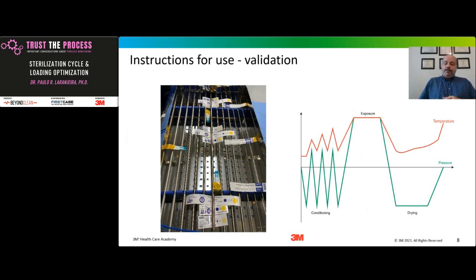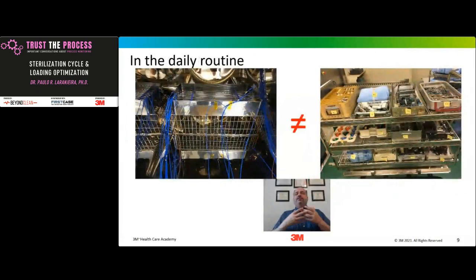Therefore, you need to follow the instruction for use, but you cannot say that that instruction for use is going to represent the same cycle and the same configuration that you have in a hospital. So this is the first point that you need to understand. When you read the instruction for use, that instruction for use is only for that medical device inside of that sterilizer. It is not on a loading configuration like you have in a hospital.